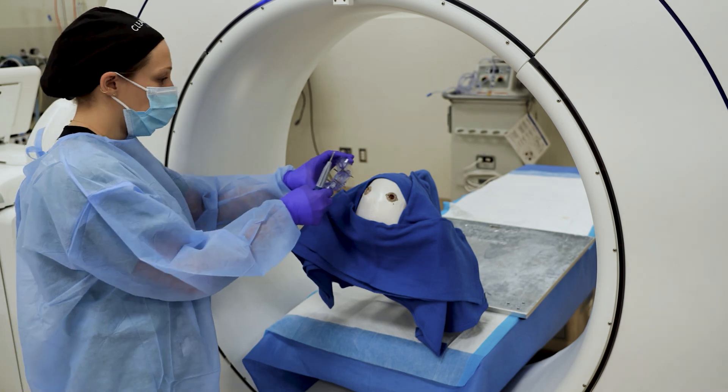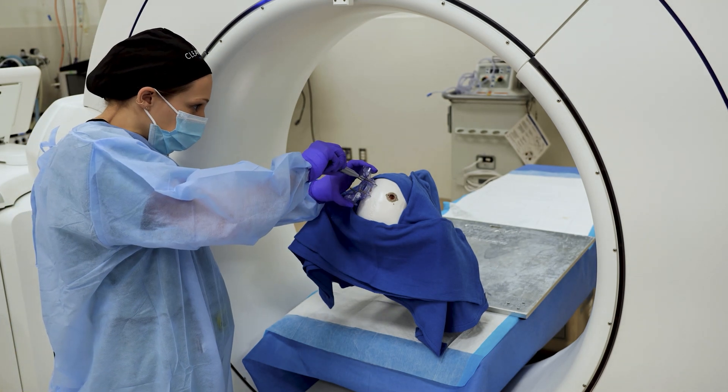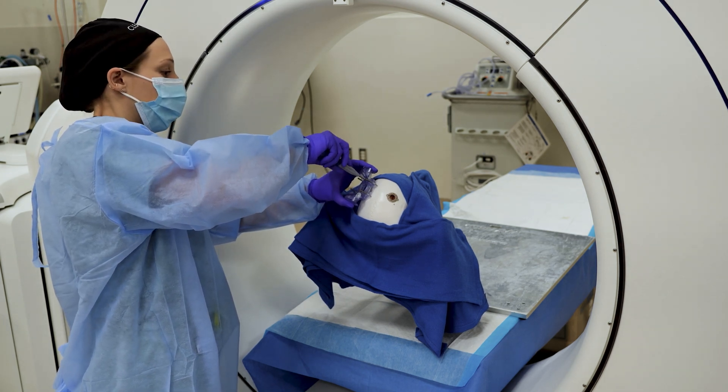ClearPoint offers two mount options: the skull mount, which mounts directly on the skull surface after retracting the scalp, or the percutaneous scalp mount that vertically raises the mount above the surface of the scalp.